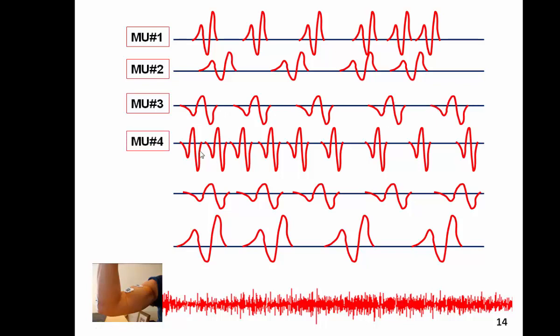The fourth motor unit, here we see a much faster discharge of the action potential, and then it discharges almost right away, and again and again, but now we start to see them spread out a little bit. So we would say with this fourth motor unit, the action potentials are starting to decrease in terms of frequency, and this is going to be something important when it comes to using the EMG to examine muscle fatigue, as we'll see in part 4 of this module.